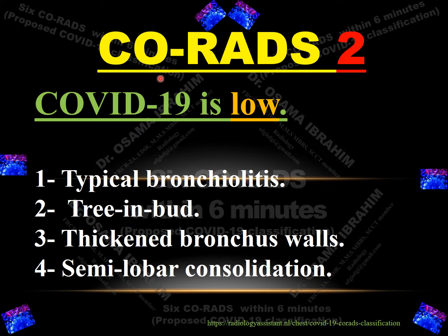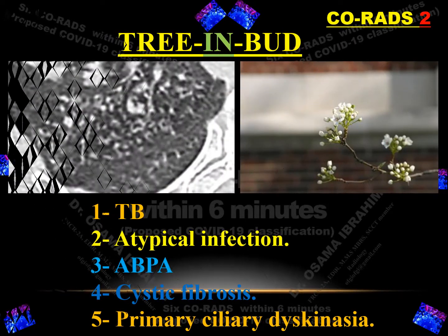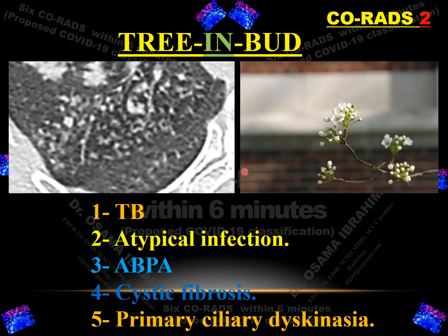The next is CO-RADS 2, which means COVID-19 is low. If there are typical bronchiolitis, centrilobular nodules, thickening bronchial wall, or lobar consolidations, we consider it CO-RADS 2, meaning COVID-19 suspicion is low. As shown with this patient with centrilobular nodules, which are considered CO-RADS 2, the suspicion of COVID-19 is low.